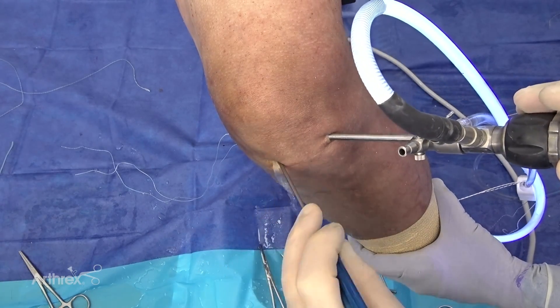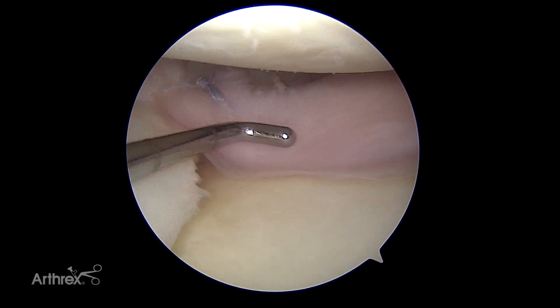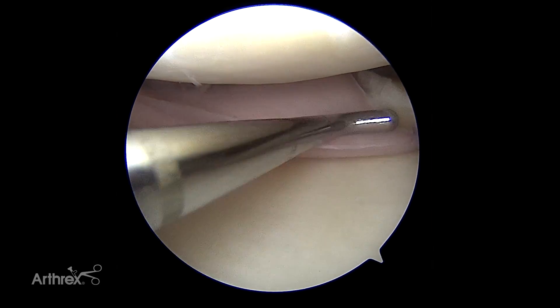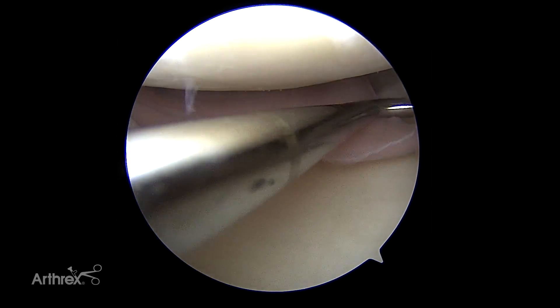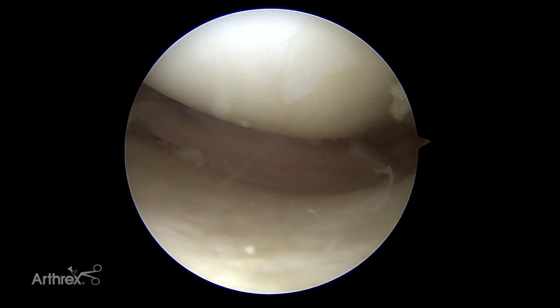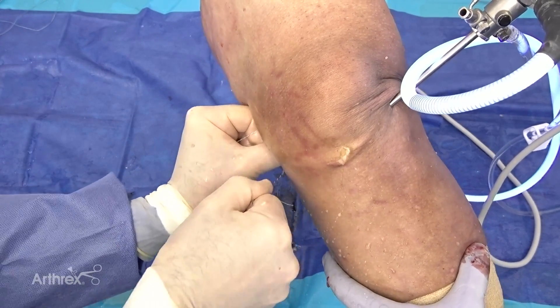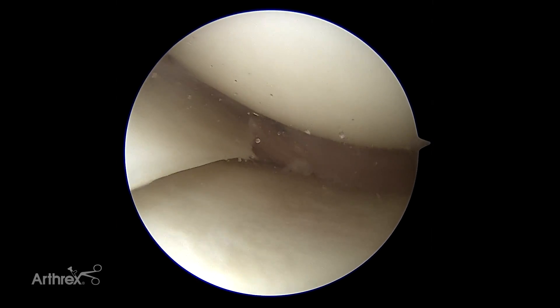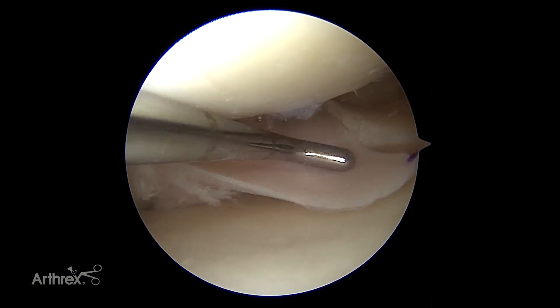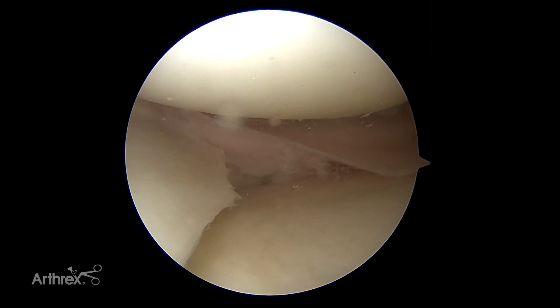You can see we've passed these sutures and we'll tie those directly to the capsule — that gives us great fixation of the peripheral aspect of the allograft transplant to the native capsule, which we prepared earlier including rasping to help get some good healing. Then we'll finish the repair as needed with some fiber stitch all-inside sutures. Looks like we have a nice fit — if we needed to trim a little of the free edge we could, but I'm more interested in having good secure capsule tissue for security of the meniscus. We'll put a fiber stitch here, here, and one in the front.